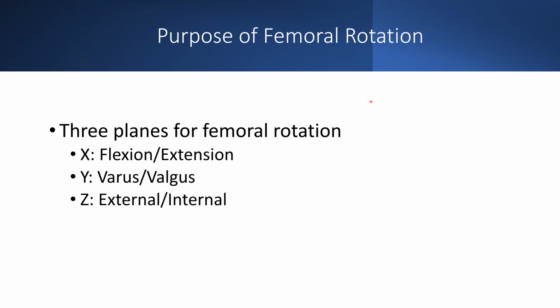Okay, so when we're looking at a knee replacement, we're often used to looking at x-rays and seeing a knee as a two-dimensional object, but of course we all know it's three-dimensional. And so there's what we call a coronal plane. When we look from the side, there's a sagittal, and then when we look along the length of the bone, that's axial. And so we have an X, Y, and Z axis. And along those axes, we can translate, we can move side to side, up and down. But for the purposes of this talk, we're talking about how we rotate along the axis.